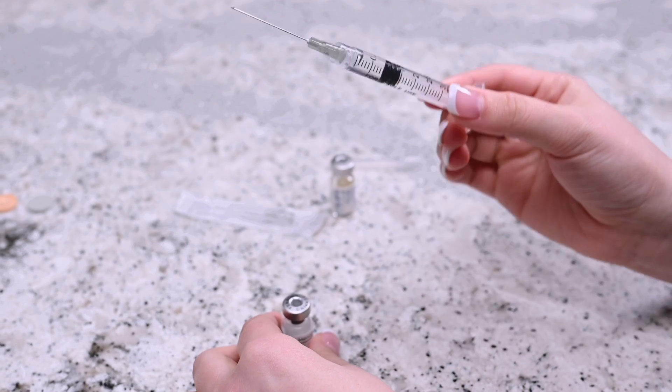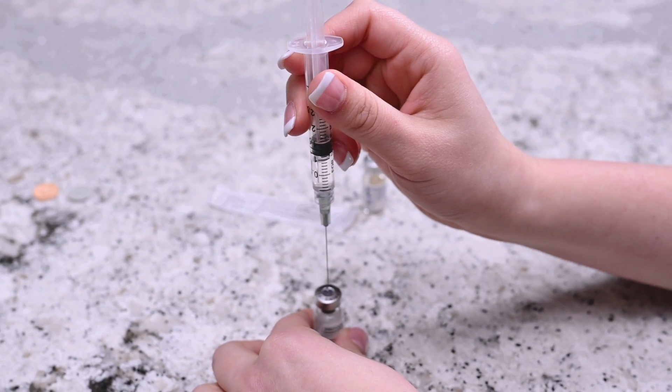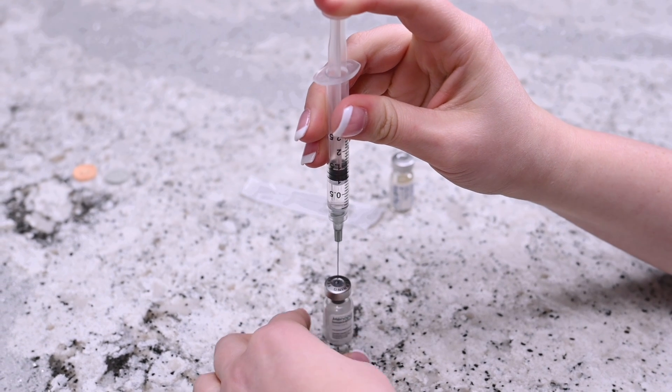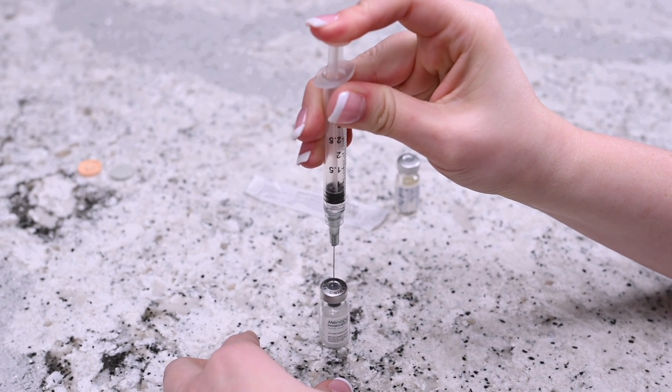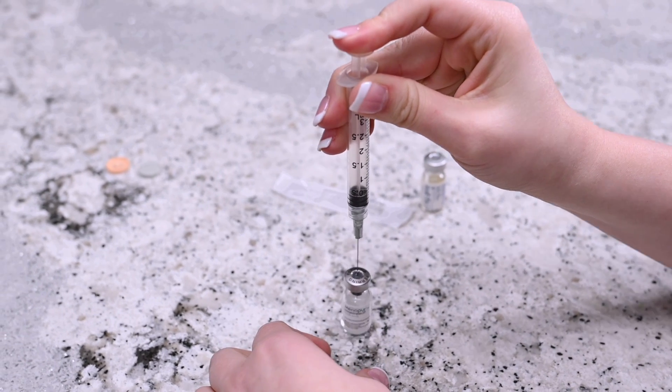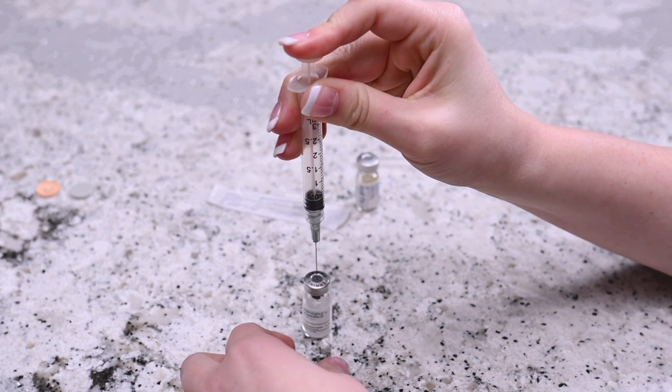Insert the needle into the rubber stopper on the vial of Menopur powder and release the syringe's content into it by pressing on the plunger. After releasing all the liquid into the vial of Menopur powder, gently mix the contents until the powder dissolves. Do not shake the vial.